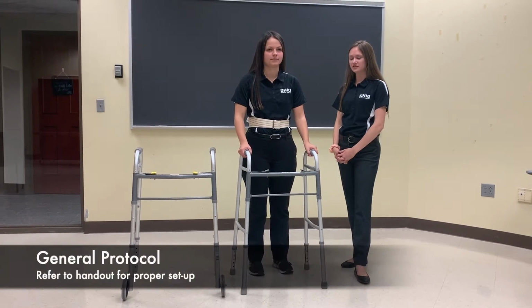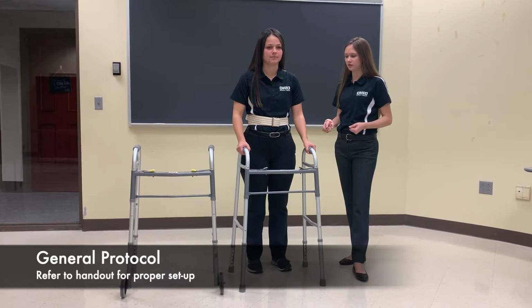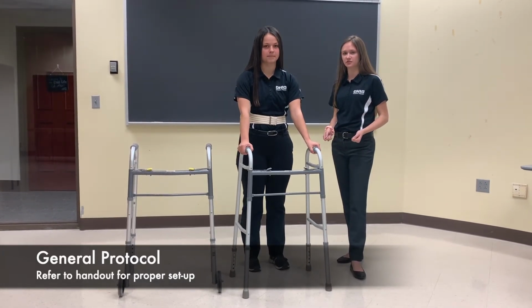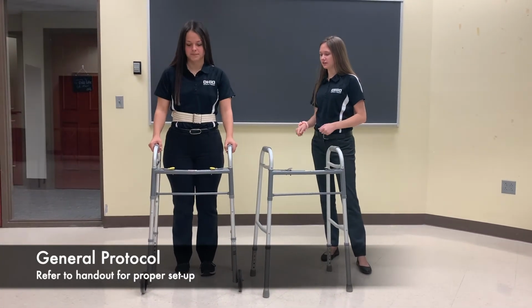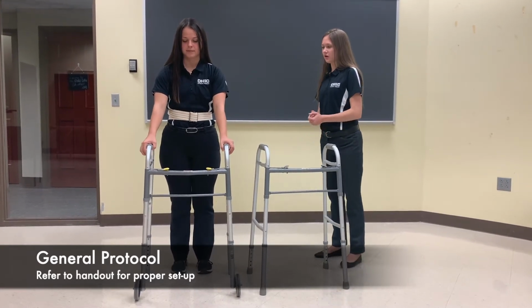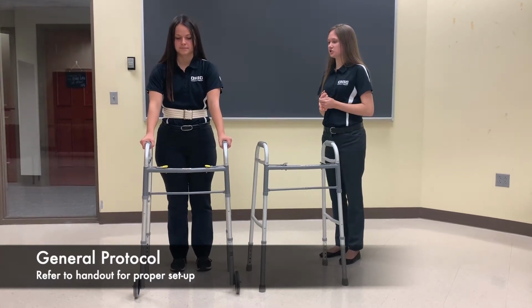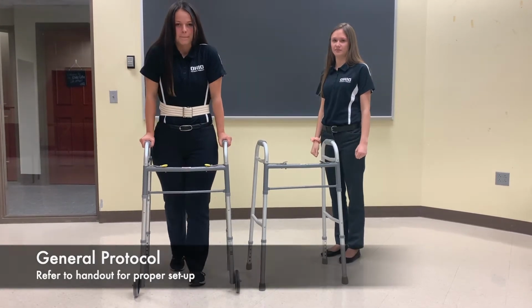When ambulating with a standard walker, the patient should begin by removing all four legs from the floor, lifting up, and then placing the walker one pace forward just past their toes. For a rolling walker, the patient should begin by lifting the two back legs up and then rolling the walker one pace forward just past the toes as well. Also, when ambulating with the affected or injured limb, the patient should place as much body weight through straight arms onto the walker as needed.